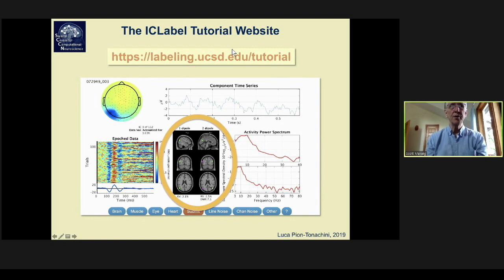So whether this makes a real contribution to the source, or is this enough, I don't know. The residual variance, that is to say, if you project this dipole through a head model to the scalp, the projection map looks almost like this. The residual variance from this IC map is only 3%.